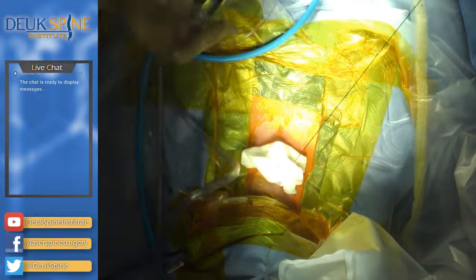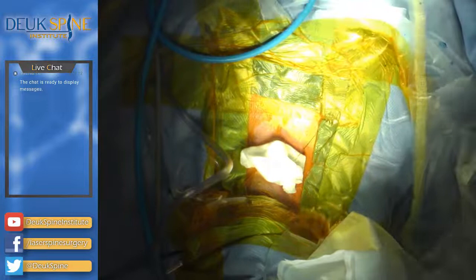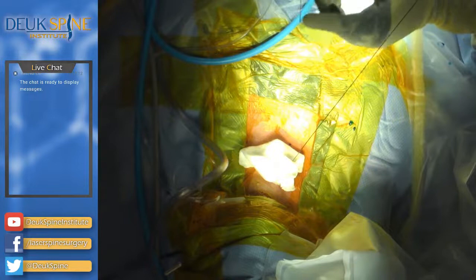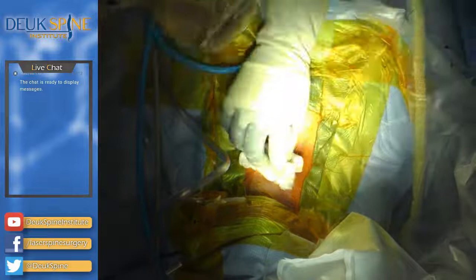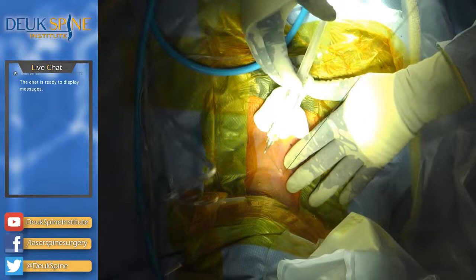We don't really talk much about the needle, but I'll take a moment to talk about it. It's a spinal needle, and it's not just any needle, it's a very special needle. It has a beveled tip, and it allows me to navigate. Because of the bevel, I can twist the needle, go up, down, left, right, and I use the x-ray to guide it. Once we get the needle in the right place, we put the guide wire through it, and now I know we have a safe path from the outside world to the part of the disc that needs to be fixed, the annular tear and the herniation.